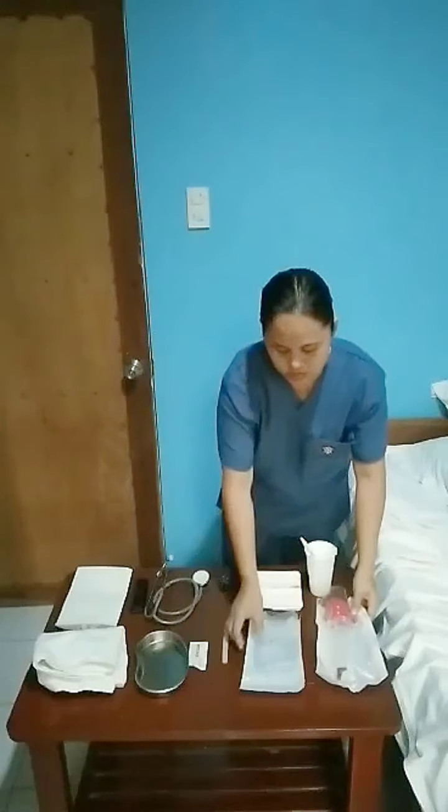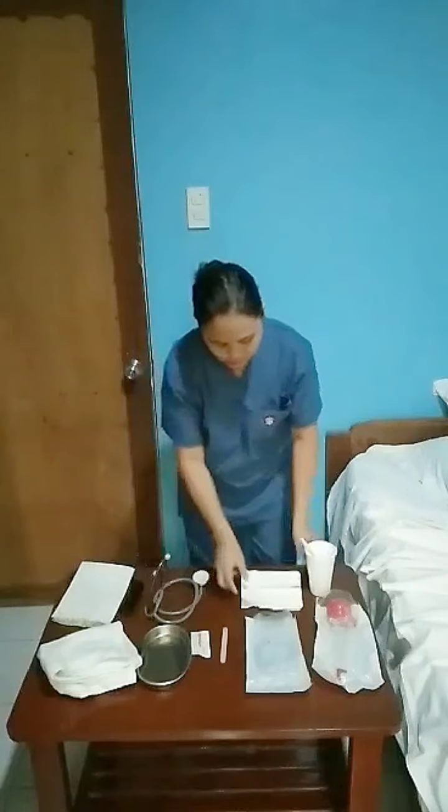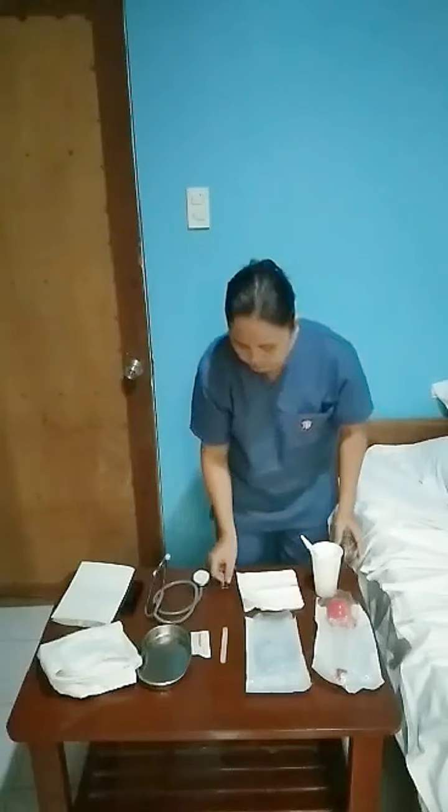The materials that we need for the nasogastric tube insertion are as follows. We have stethoscope, the irrigation syringe, the nasogastric tube using the right size according to the doctor's order. We have tongue depressor, the water, lubricant gel, the kidney basin, towel, sterile cloth, penlight, tissue, a glass of water with straw, and then safety pin.